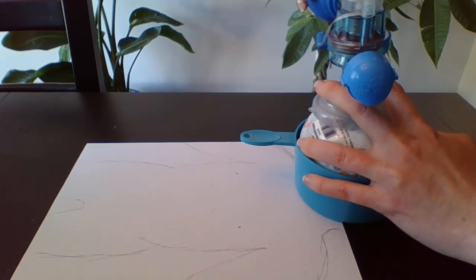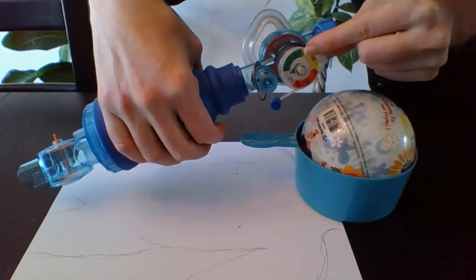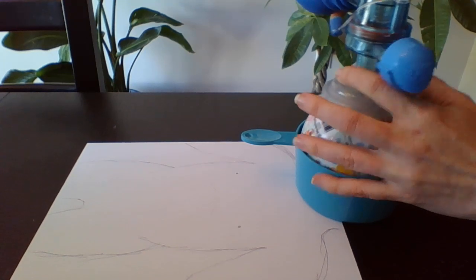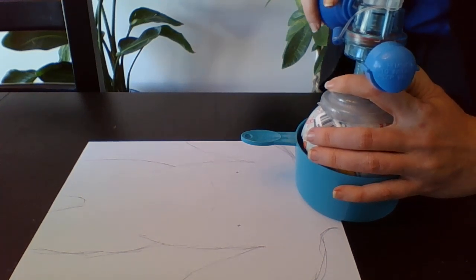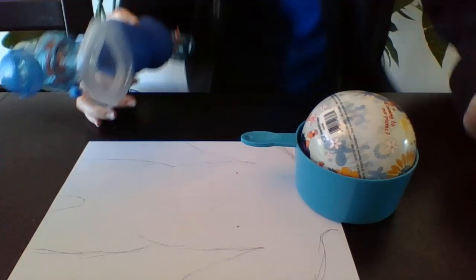And you're going to start with lung inflation breaths, which get you up to about the 30 to 40 range. So in the yellow is where you want to go for at least the first 5 breaths. And typically what they want is for you to give ventilation for the first 15 seconds before checking the heart rate again and seeing if the baby has started to breathe on its own. In my experience, the baby usually barely gets through 5 breaths before it starts pushing you away and going, no, no, no, okay, thank you so much, I appreciate that, I got it now.